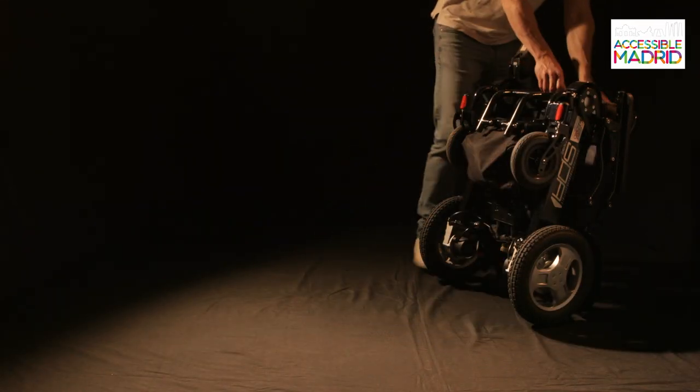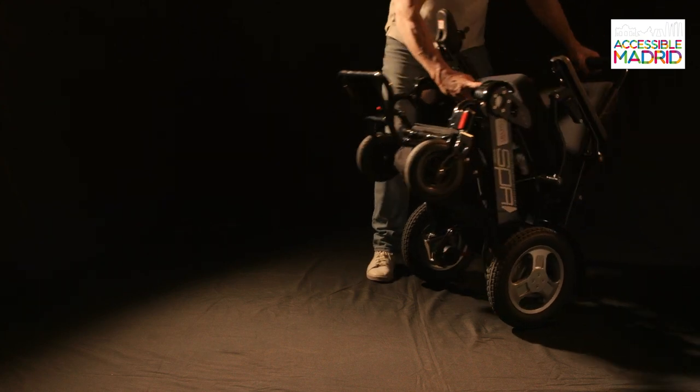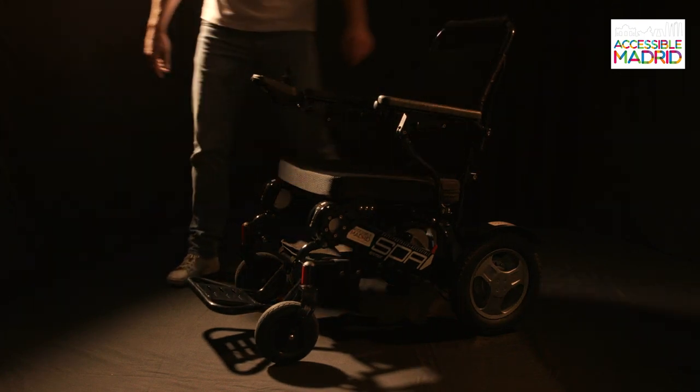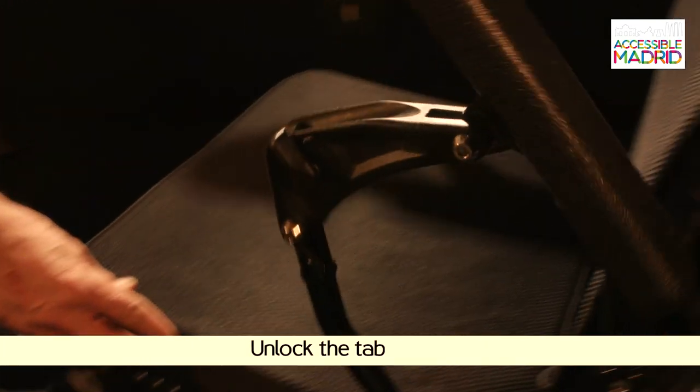To open the chair, we will unfold the footrest and apply pressure with one hand on the backrest and the other on the seat until fully open. The armrests can be folded to facilitate access to the chair.